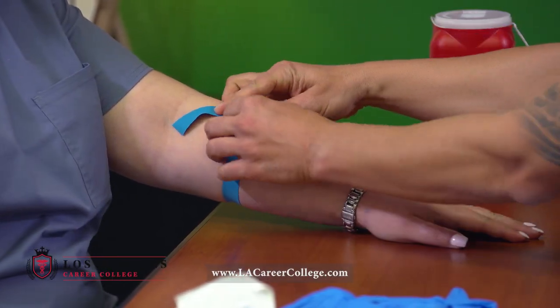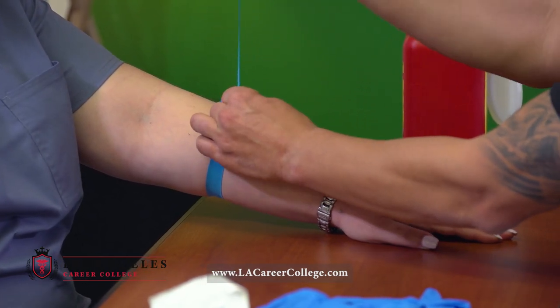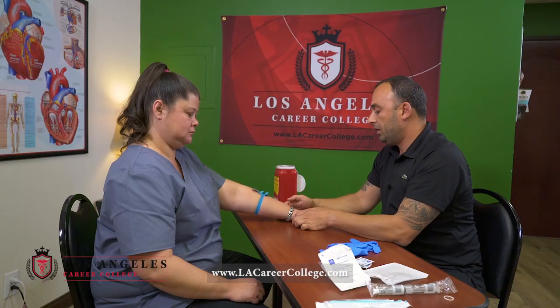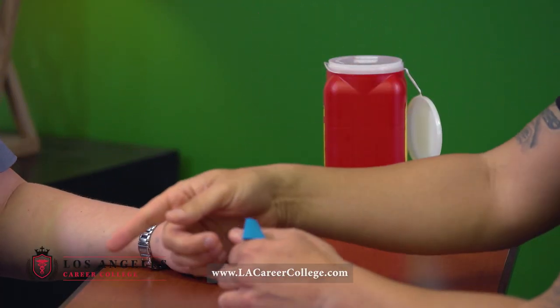Same thing — make an X. Hold on to one side and then hold on to the other side and pull. The flap that's facing me is gonna get tucked in, again five fingers away. I do see another vein here, but I like the other one better. So I'm gonna go ahead and release my tourniquet and set up to start an IV on the right arm. Sounds good? Yes. I'll be right back.